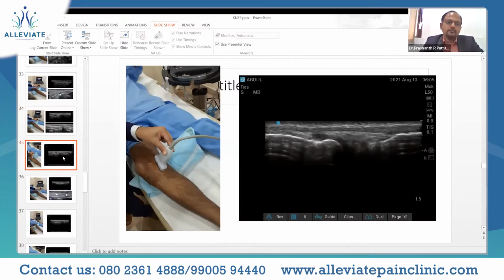So further, when you externally rotate and place it more inferior, we are able to visualize this particular structure, which is of mixed intensities, hyperechoic to hypoechoic, band-like echogenicity, extending from the femoral condyle up to the tibia. So this is the portion of the medial collateral ligament. And then the portion of the meniscus is also visible over here. You know that the medial meniscus is more amenable to strain in the knee joint because it is closely attached to the capsule and the MCL as well.